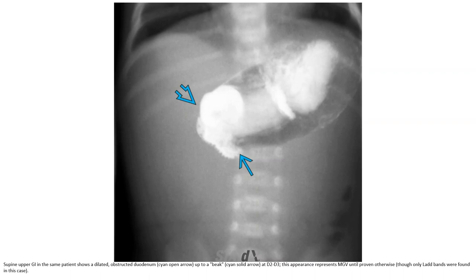Supine upper GI in the same patient showed a dilated, obstructed duodenum. This appearance represents midgut volvulus until proven otherwise. Ladd bands were found in this case.